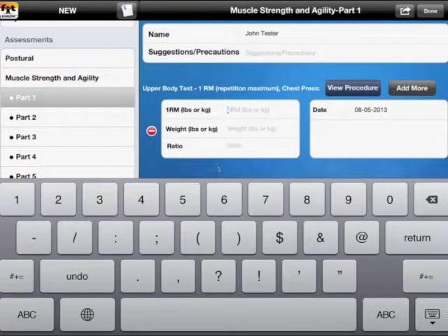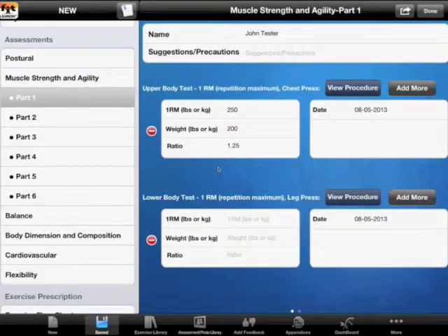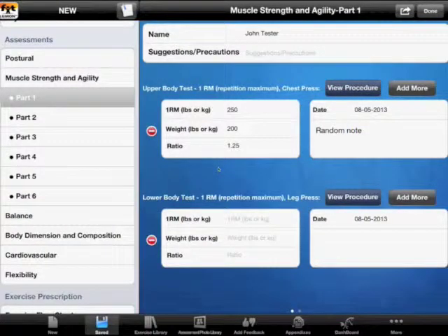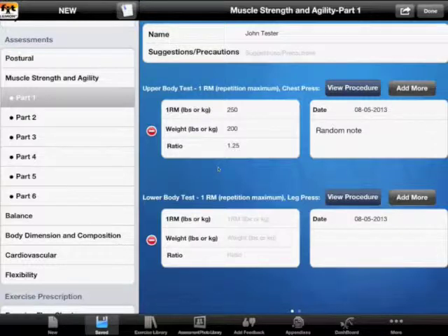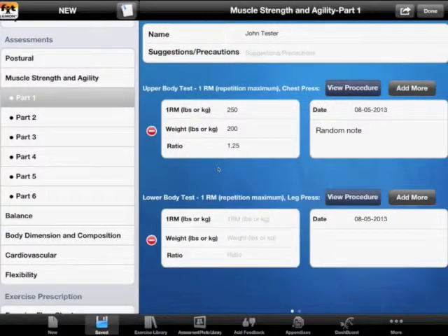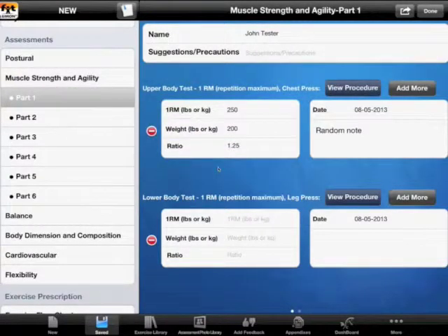We input the weight of our client. After inputting the second number, a ratio will be calculated automatically. We can also add notes to confirm if we've done it according to the standard procedure or if we introduced any adjustments. We can also change the date, and to add more entries we just click 'add more' to put a reassessment in here.